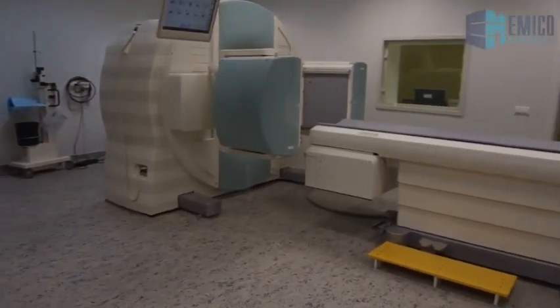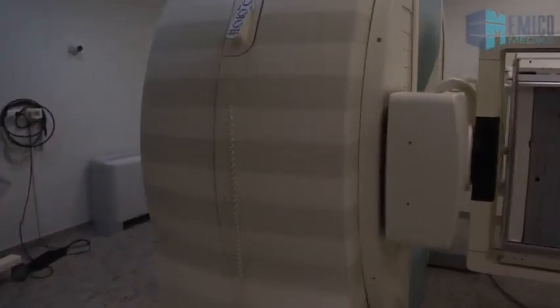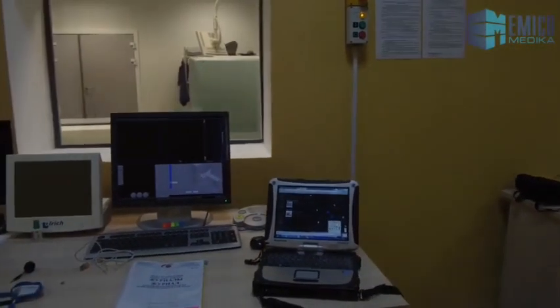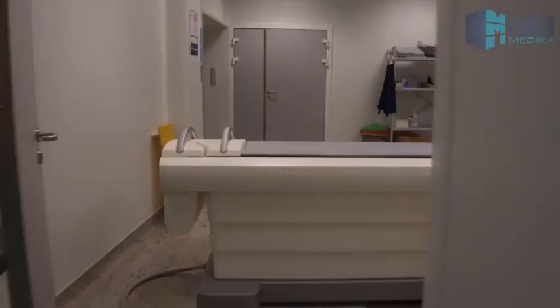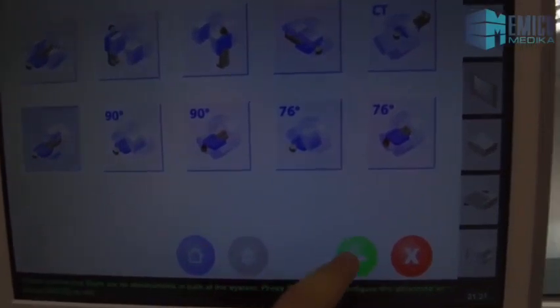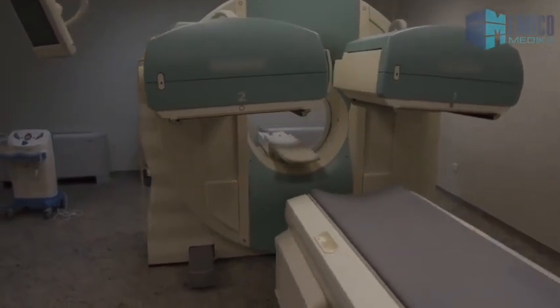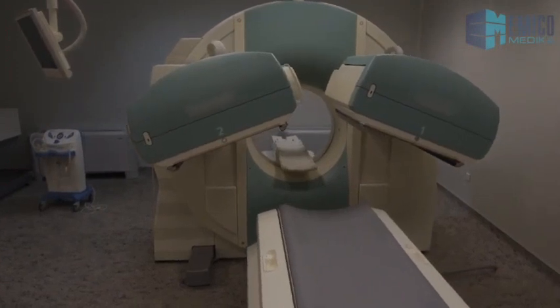This includes observation of all radiation protection rules as applicable to nuclear medicine, use of appropriate safety devices, remote handling of tools and accessories, and maintaining good housekeeping habits in the laboratory. In addition to the external irradiation, there is a chance of radioactive contamination while handling unsealed sources in nuclear medicine procedures. The radioactive waste generated during preparation, dispensing, and administration of radiopharmaceuticals shall be handled carefully to minimize exposure to staff and the public.